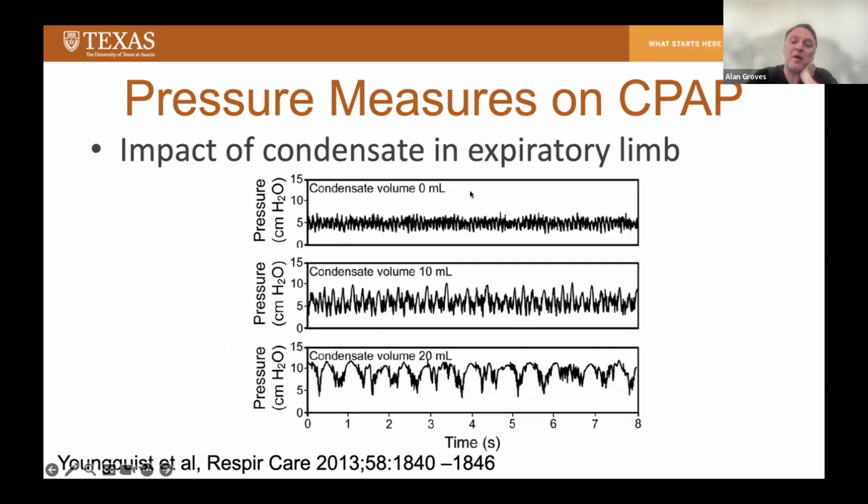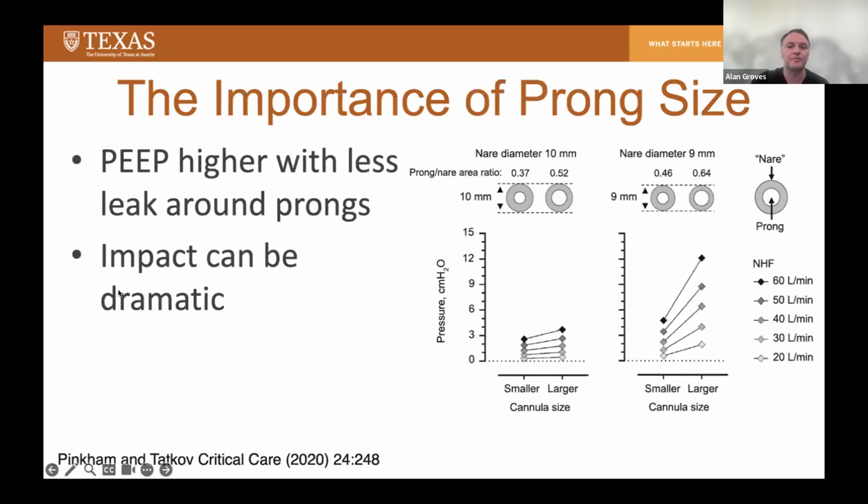The strength of that bubbling also seems to have a great big impact on the swings in pressure through the respiratory cycle. So here's the gentle oscillation that we see in all babies on bubble CPAP. Some people believe that these oscillations help with CO2 extraction in the same way as we do with babies on the oscillator. Some people think that's less of a significant component. I really don't know. But I think we would all agree that whenever we're seeing these very wide swings of pressure, dropping down to 5 and then up to about 12, that swing of pressure is probably not great for our babies to be getting.